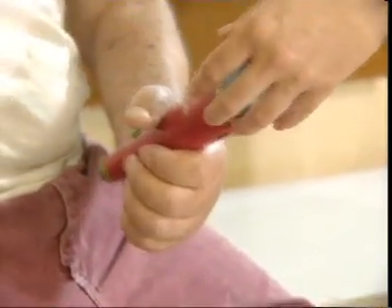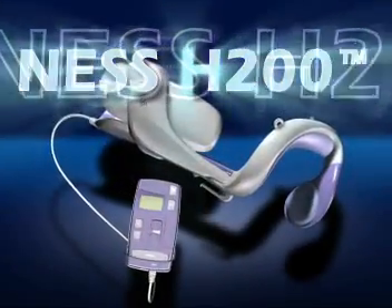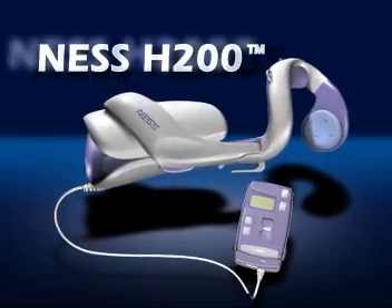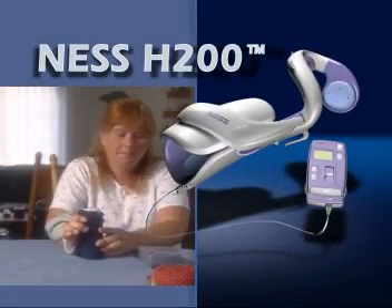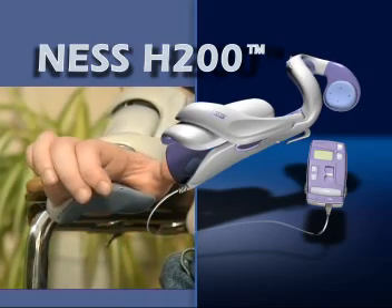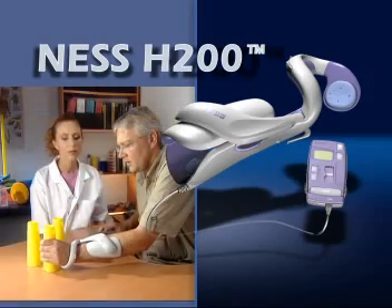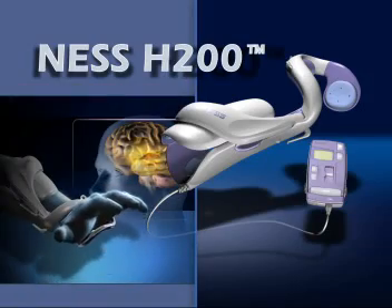Changing the way we treat paralyzed hands. The Ness H200, a breakthrough development in physical medicine and rehabilitation. This advanced neuroprosthesis and rehabilitation system is designed to improve hand function, while reducing complications associated with disorders and injuries of the central nervous system.